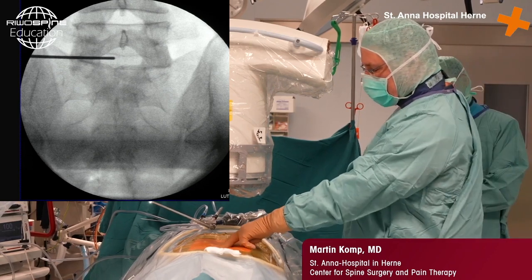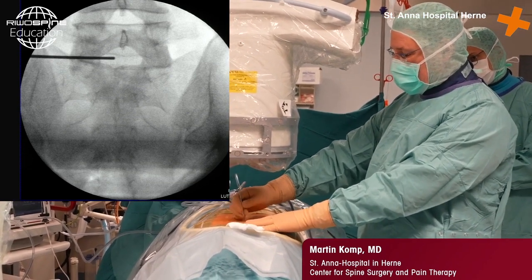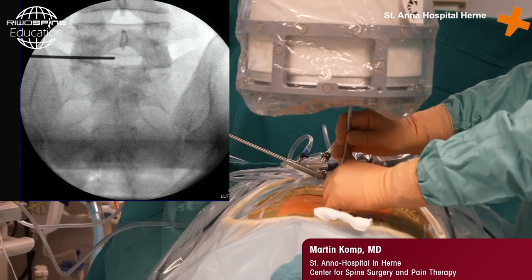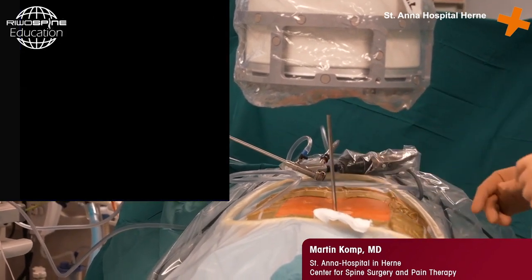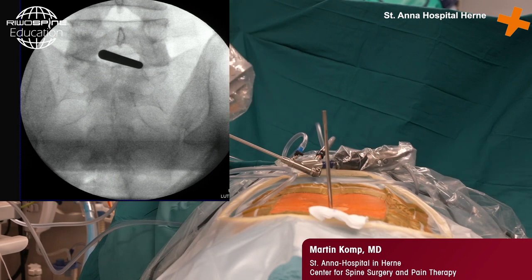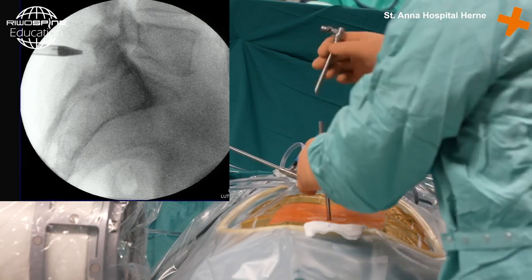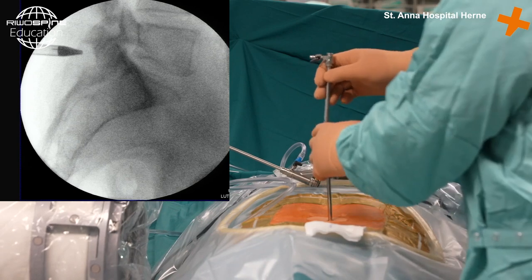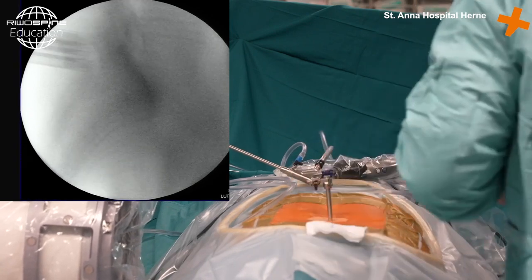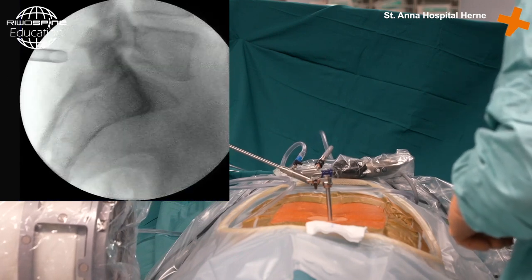When we do the skin incision, it is useful to cut into the fascia too, so a 5 to 6 millimeter skin incision. Then it depends a little bit on the fat tissue what you have. Then we change into the lateral C-arm position. So the direction of the dilator is towards the disc space. Then we insert the beveled operation cannula, opening to the medial aspect. Direction to the disc space. So, and the approach is ready.